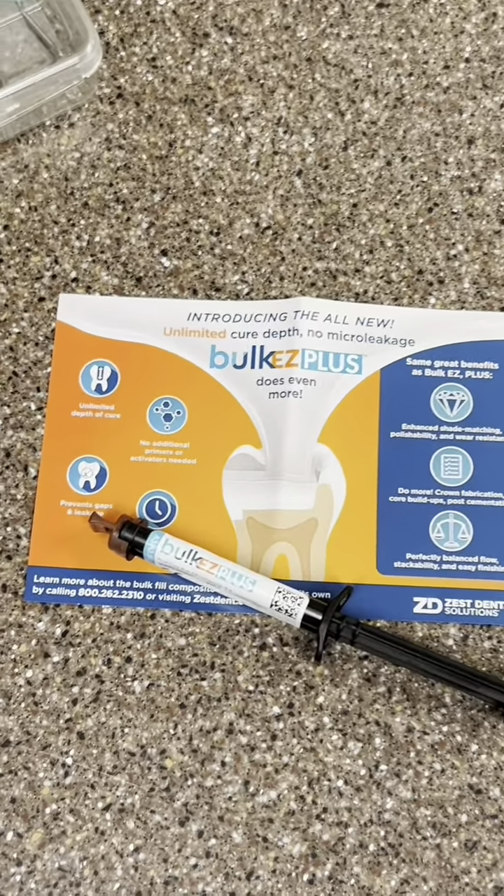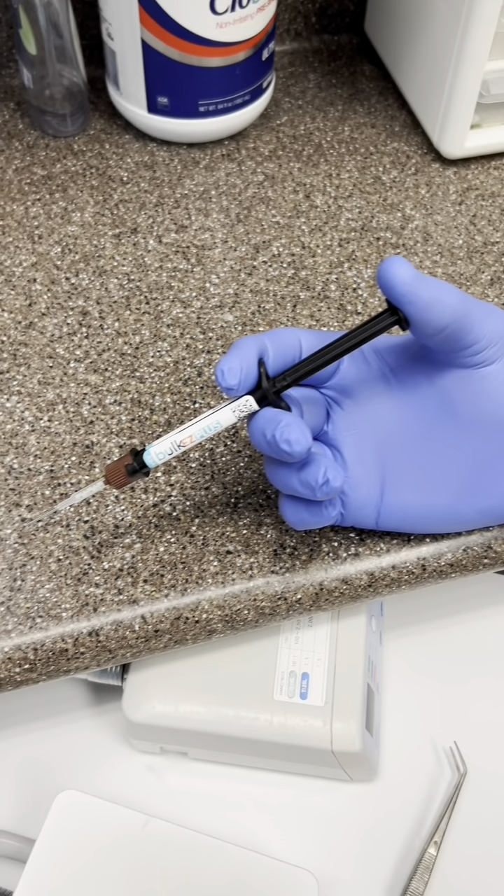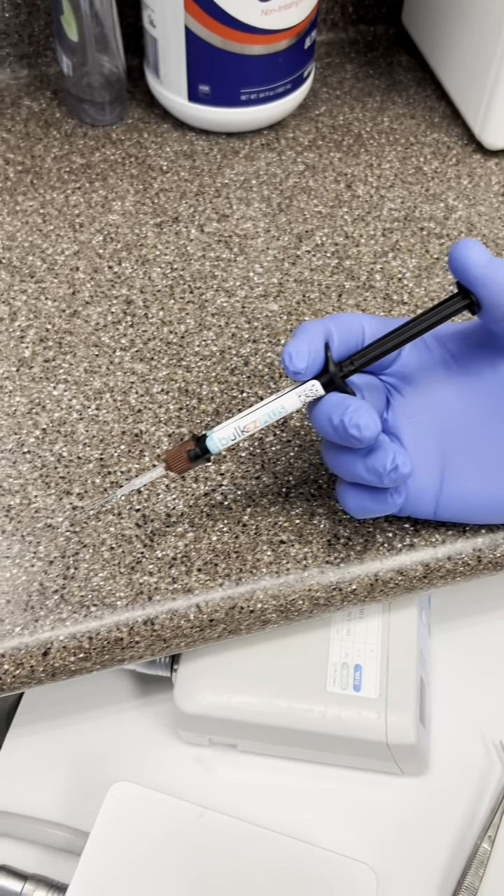Bulk EZ has been in my practice for eight-plus years now. With the new evolution of the Bulk EZ Plus, it's a must-have for all dental practices in 2024. What makes Bulk EZ Plus so unique is its dual cure capabilities, and what's so important about dual cure capability is ultimately in direct restoratives.